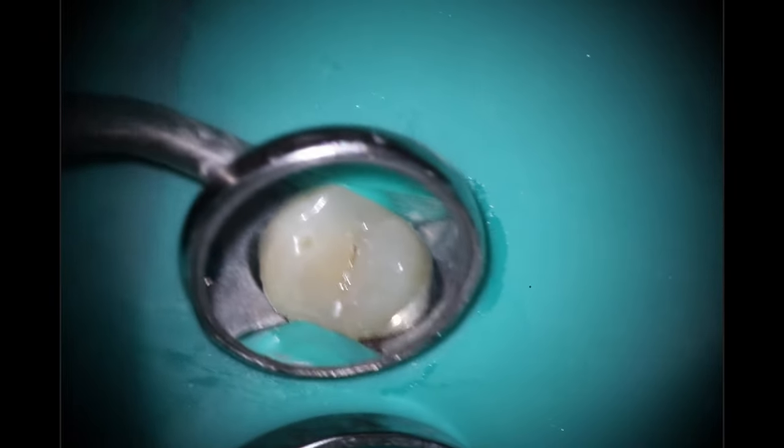Starting off here — for my access I'm going to start by flattening the tooth off. And you can see that looks absolutely terrible. So let's go ahead and use the Mirror Magic from Zerk, and you will see how much better this mirror looks here in just a second. And voila — that's why I absolutely love that stuff. It does create that nice hydrophobic layer on top, so the water just beads up instead of causing all these issues.